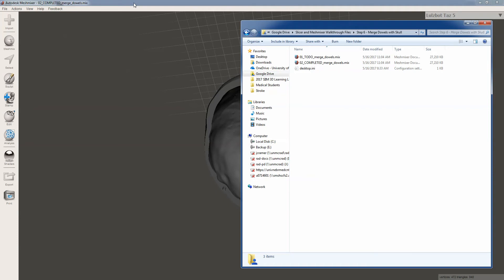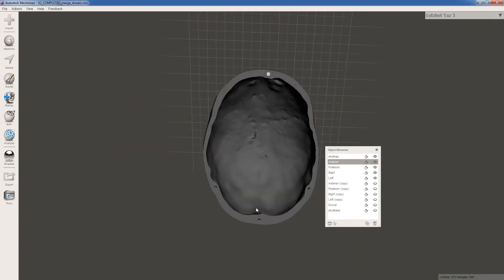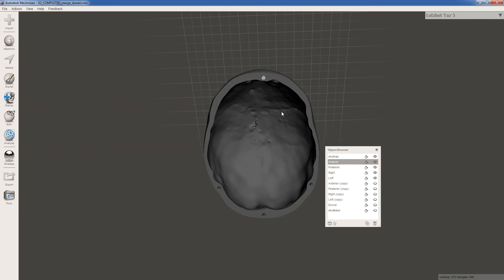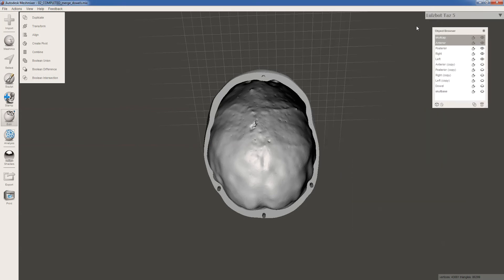So you should have the to-do mergeDowels.mix file open, and we're going to start creating holes in our model. We have our skull cap and our anterior dowel. Hold down control and select both of those in the object browser. When you do, you're going to see under the edit menu you now have some different options — Boolean union, Boolean difference, and Boolean intersection. These are fairly self-explanatory: a Boolean union would combine those two, and a Boolean difference is going to subtract the two.